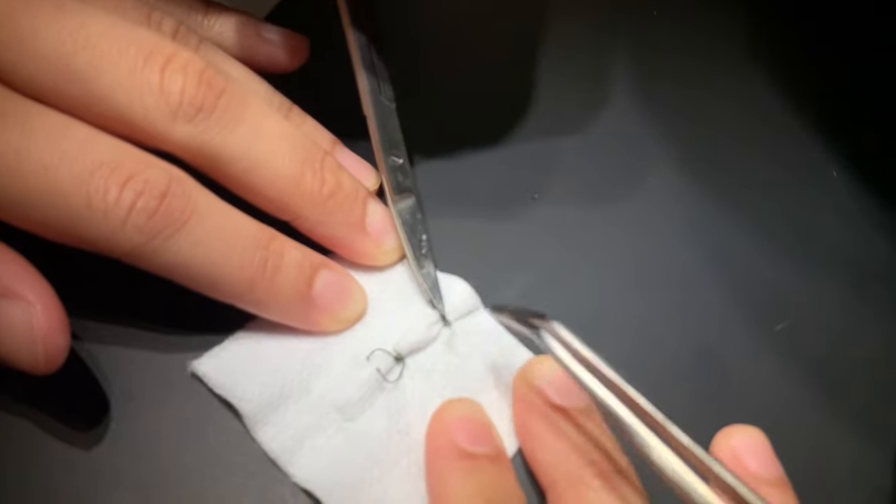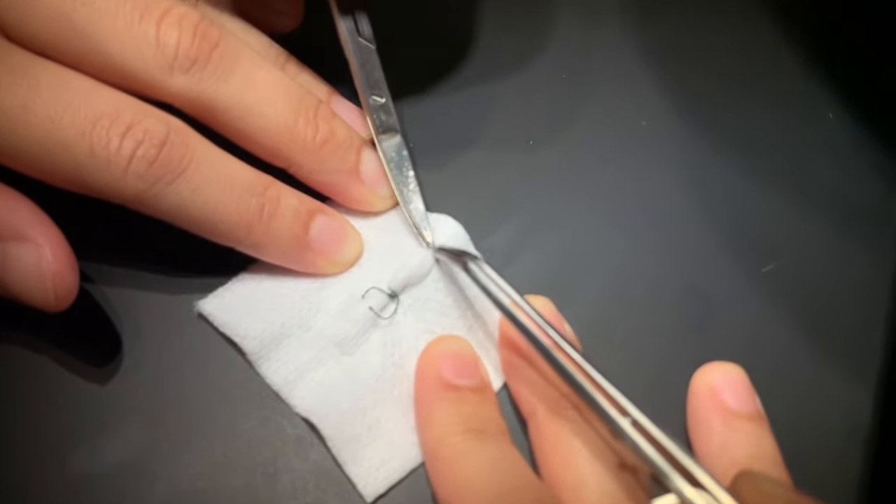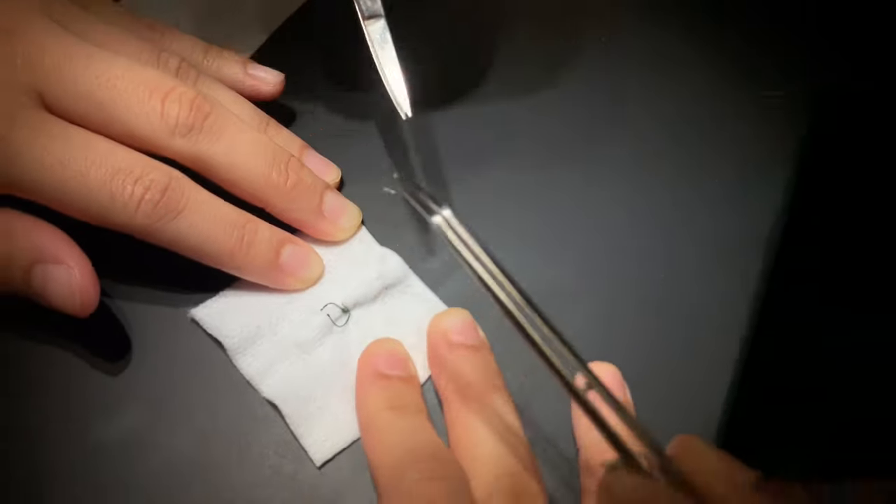There you go! Grip that thing — oh, there we go, now it's locked. It's going to be good. That was not good.